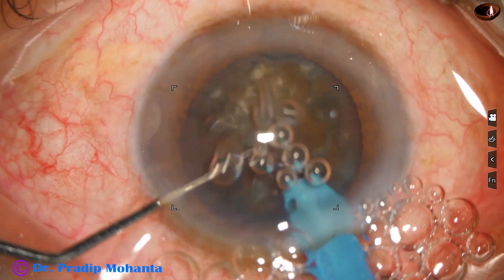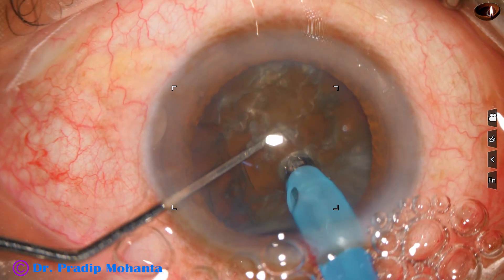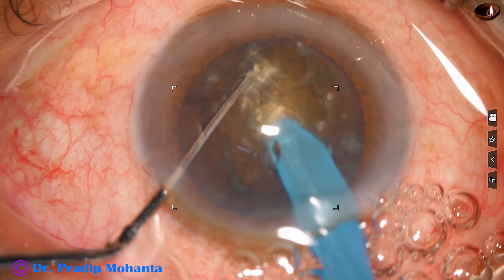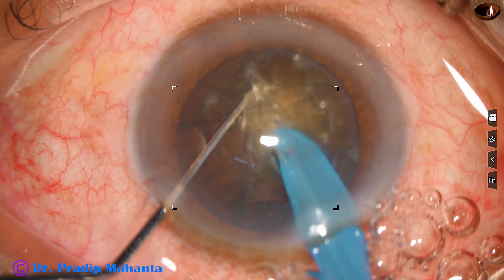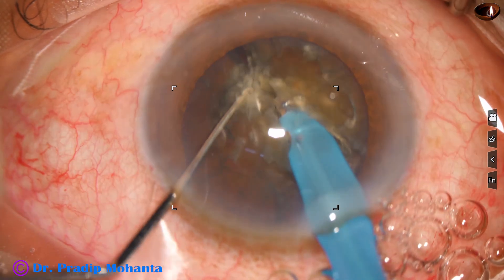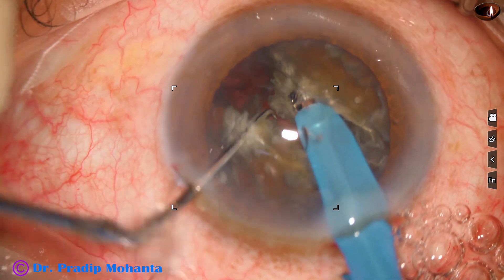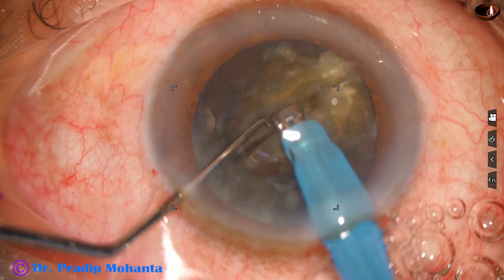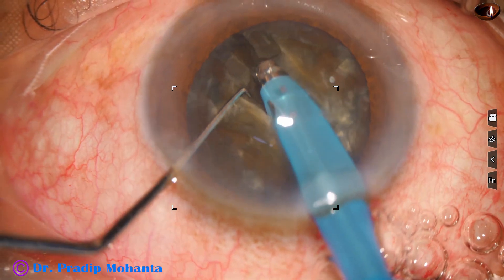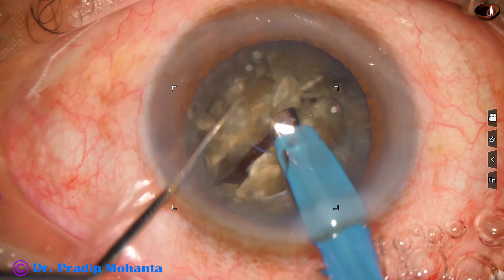The tip is buried just in front of the main incision and goes through the substance towards the opposite equator with full ultrasonic energy in continuous mode at 450 vacuum. You can see a crack, and along the same crack I use the chopper and divide the nucleus. I come to the other side, do a sculpt, hold, and separate the 2 hemi-nuclei completely.